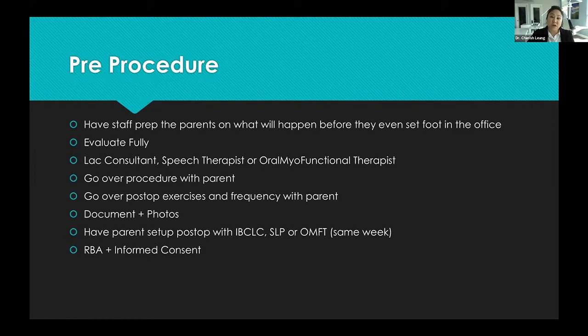I always also like to document and take before and after photos. The reason for that is you want to make sure you're able to show the parent, this is what it looked like before, this is what it looked like after. Also for billing purposes later, sometimes they do ask you for those photos. And then I like to have the parent, like I said, set up that appointment for the same week if possible with the lactation consultant, which is an IBCLC, or the speech therapist, or the oral myofunctional therapist. Those are all really helpful, again, to retrain that muscle.